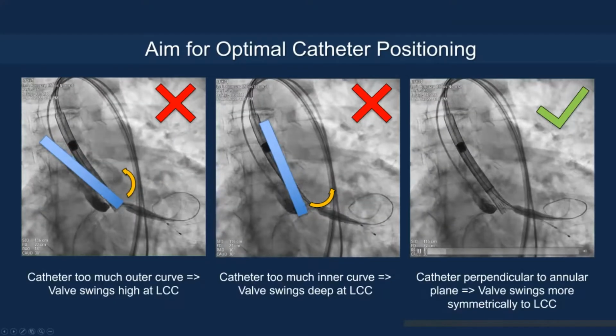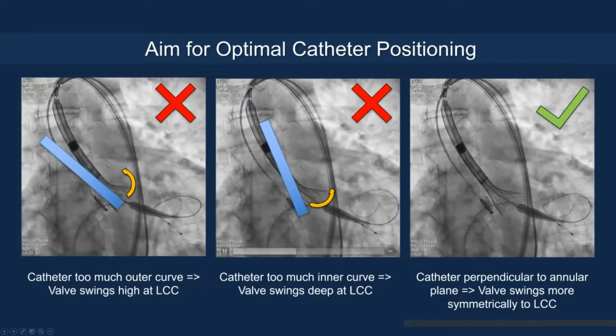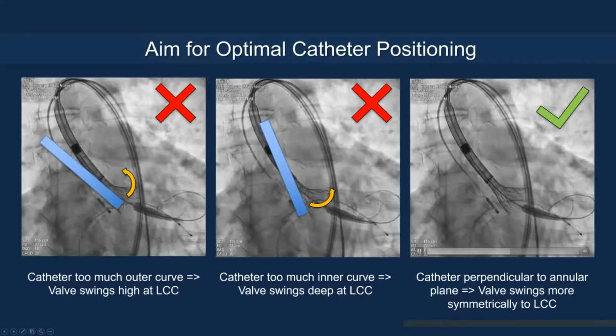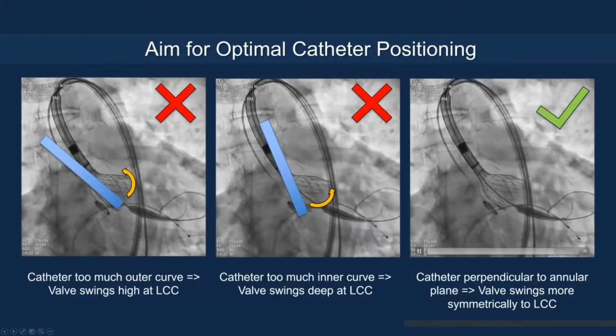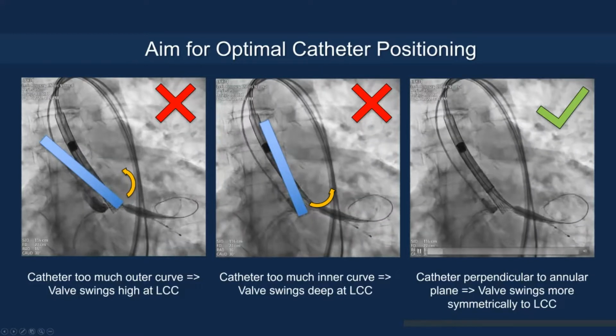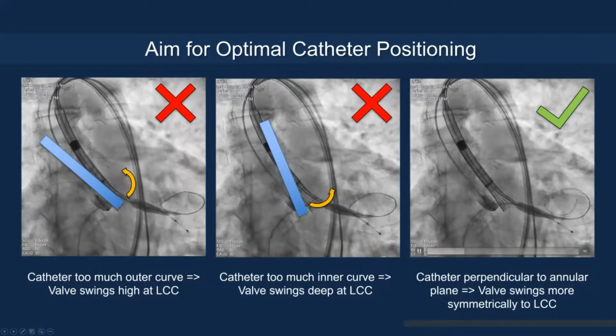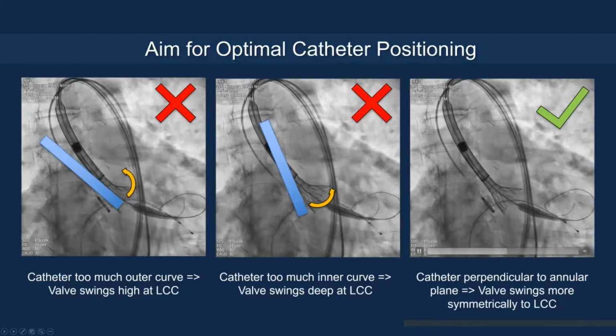Now, here's what you do not want to do. You can see the right side of the screen here, the FX catheter is pretty coaxial and centered against the native annulus. That is the ideal coaxial deployment at the cusp overlap view, because you're not going to be going too deeply on one side or the other.